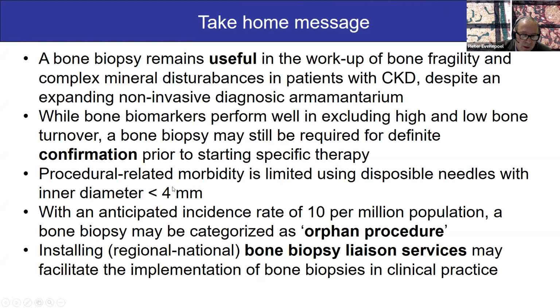We should emphasize that the procedure-related morbidity of a bone biopsy nowadays is limited when we're using disposable needles with an inner diameter of less than 4 millimeters. And again, this yields sufficient material for a formal pathological diagnosis.